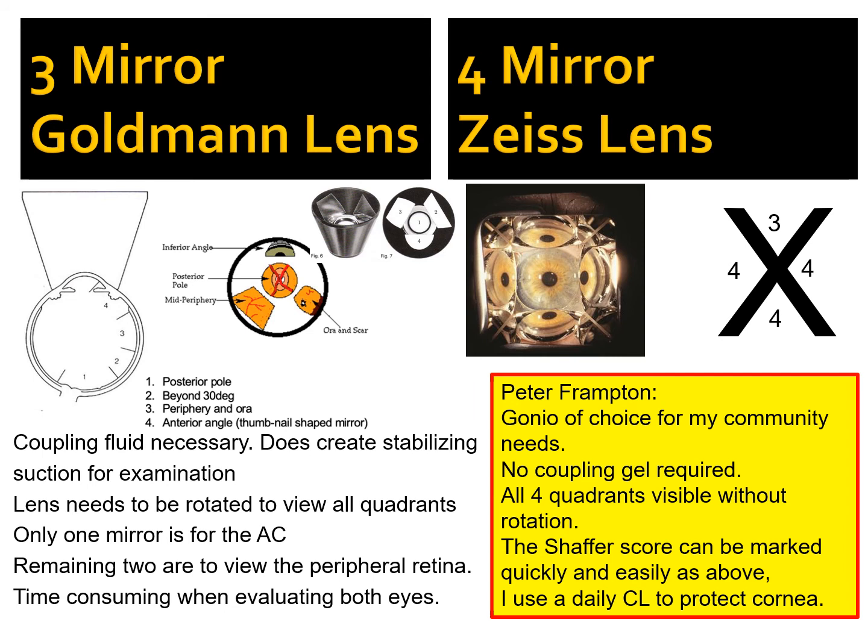So if anyone is interested in doing it and wants that little bit of extra protection, I would highly recommend the idea of doing the daily contact lens. But it does mess up the system again. It's adding another layer of time to doing something that you maybe want to do quite quickly. But certainly it works very, very well. But that's the thing that got me thinking about what is the advantage of this to the patient, what are the risks, and is it in the patient's best interest for me to muck around with this thing?